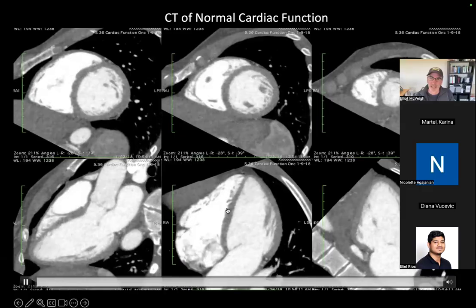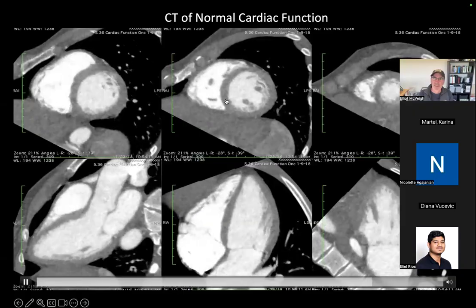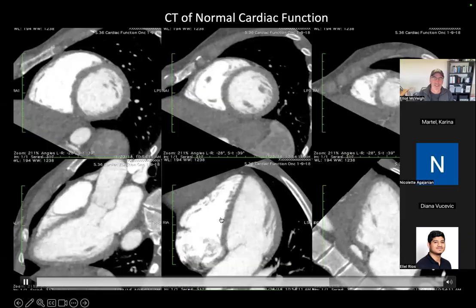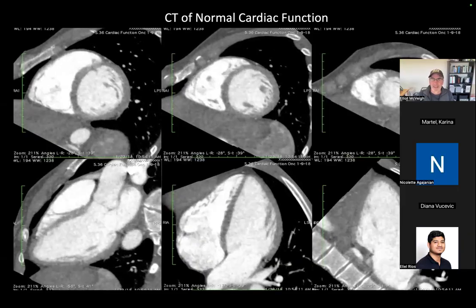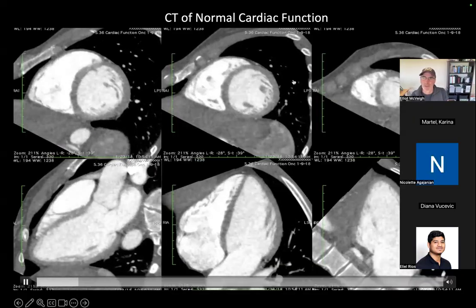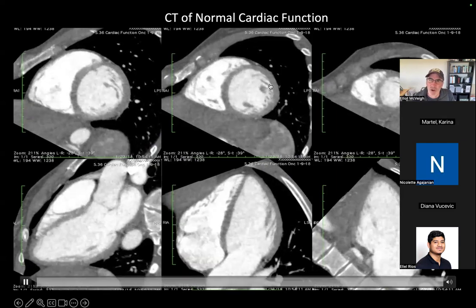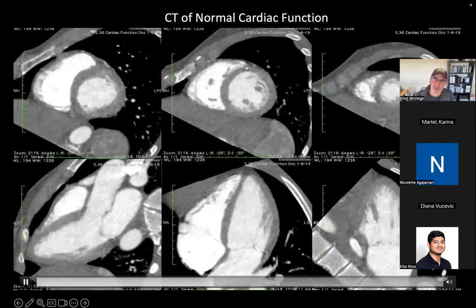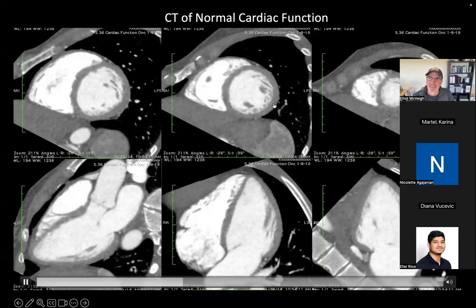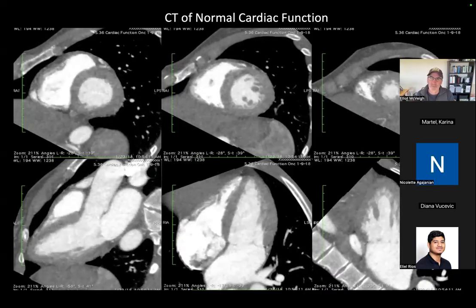So you can see a fantastic view of the septum of the heart and the septum here. You get an amazing view of right ventricular function, which is hard to get with echo. And this is in the classic views, right? I have short axis slices, those donut views. I can measure radial thickening. So what's the percentage increase in the wall in this direction? I can measure circumferential shortening. What's the change in the circumferential distance around the heart as it goes down? That's a strain, right? A myocardial strain.